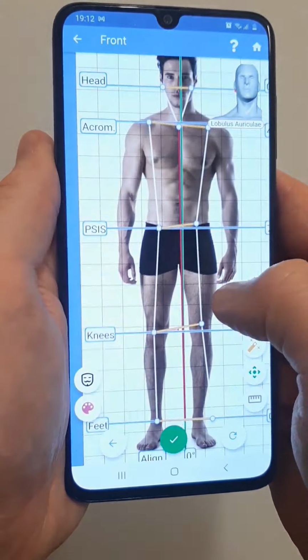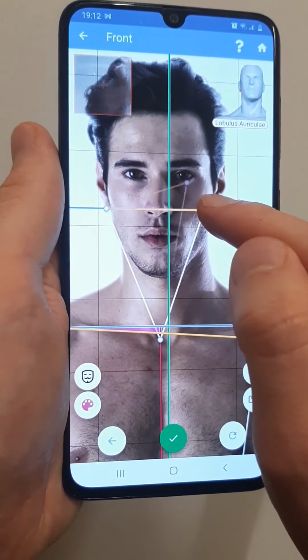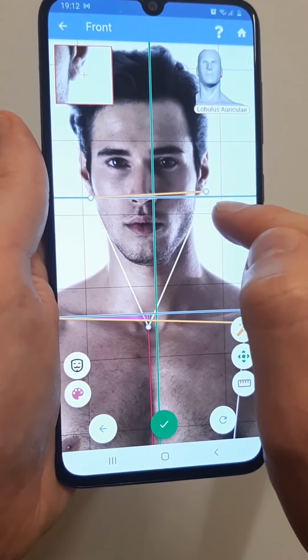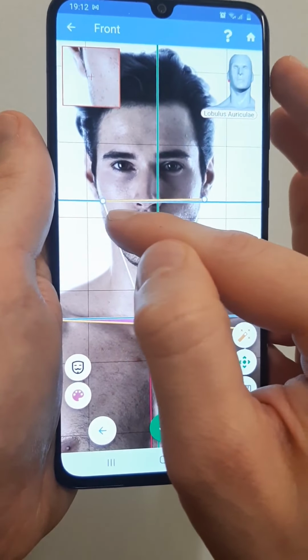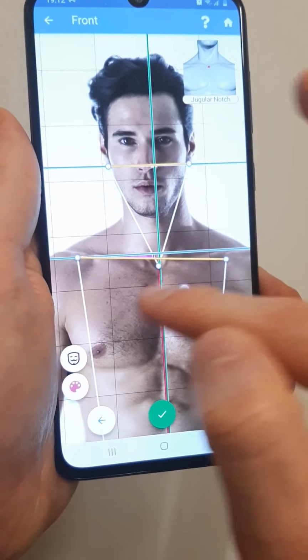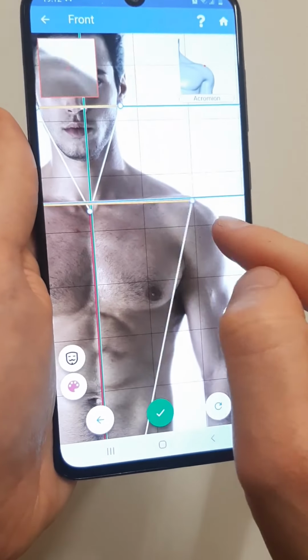So in auto positioning, as was mentioned, APECS will preset all the markers at the same time. So what you have to do now is reposition them to their proper location. So as you can see, to do that, you press on the marker. The marker will be activated. You still have the anthropometrical landmark in your guide. So you have to relocate this marker to its correct place. The markers appear in approximate location, but you still have to validate them. So I will accelerate.